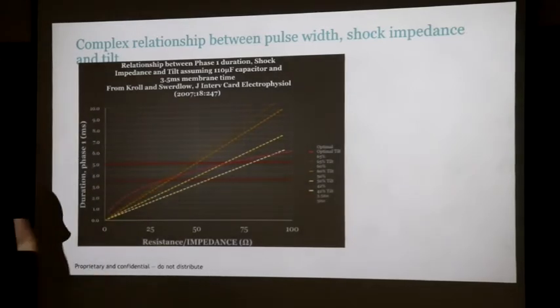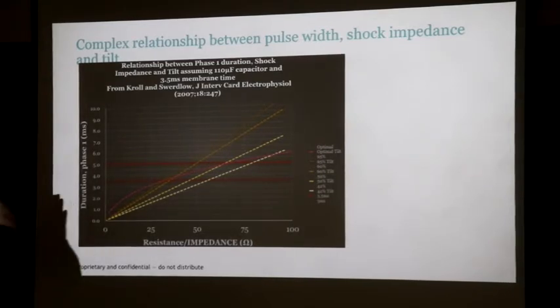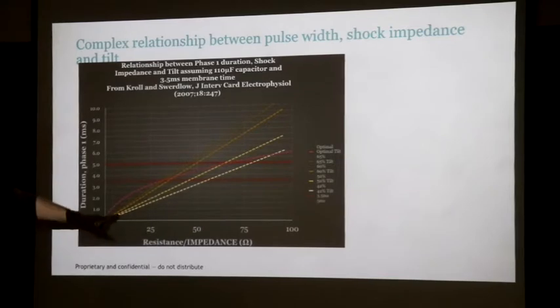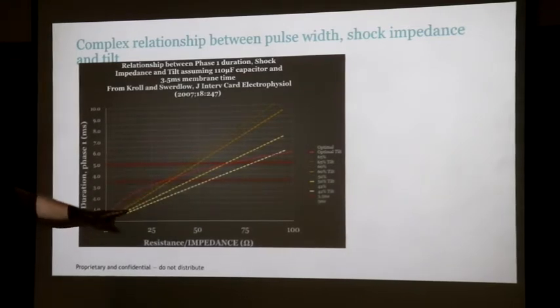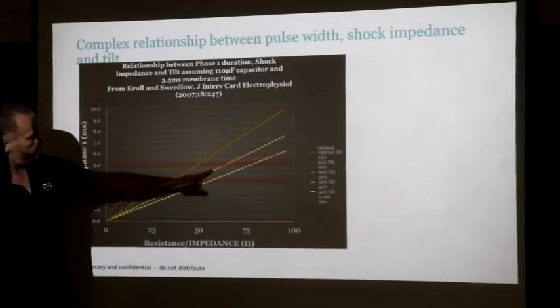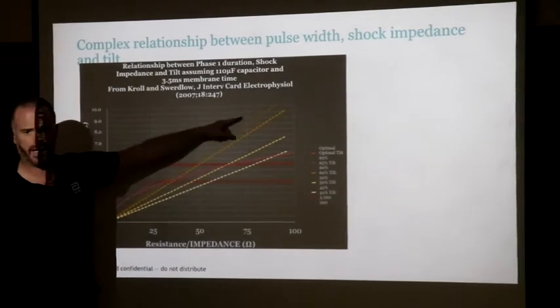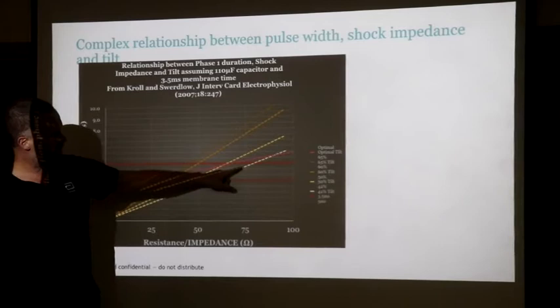So if we change the tilt value, which then changes the duration of the waveform, we can then go, okay, what would we want to program? Well, let's look at 50% tilt. Here's 50% tilt running up here. He's at around 70. So not good enough. It's close. It's better than that. So the optimal tilt in this man would be at 42%.